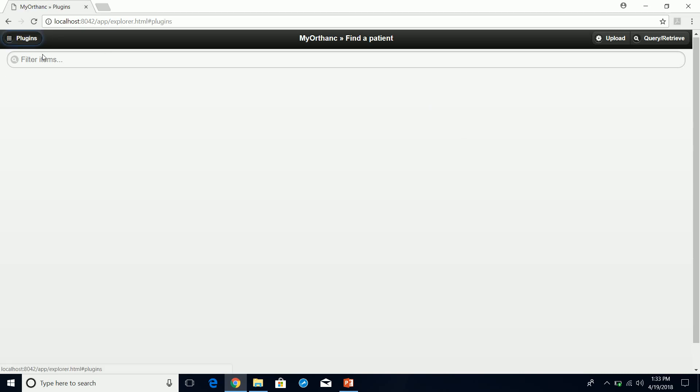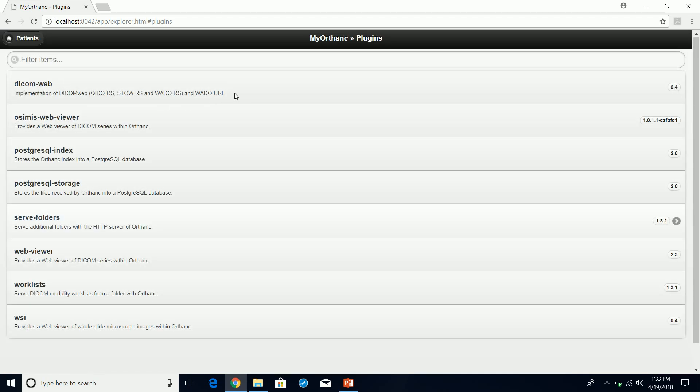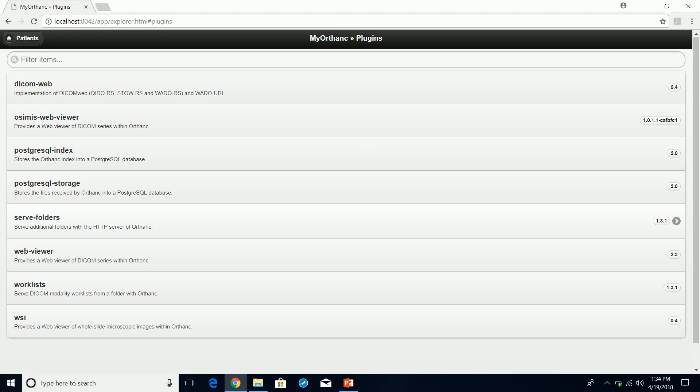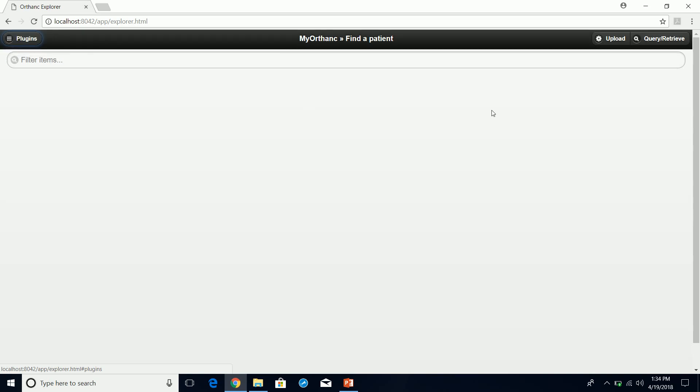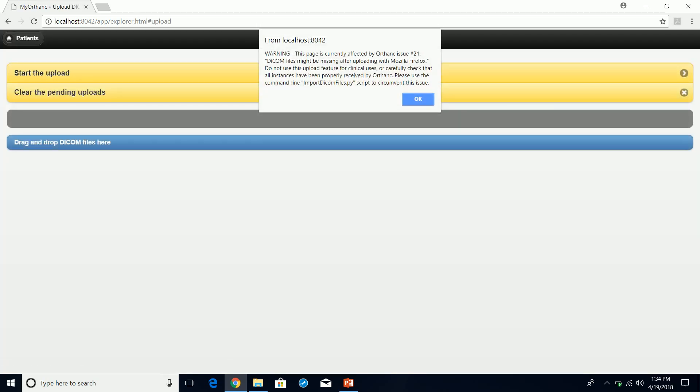It gives you by default some optional plugins - some of these plugins you have to purchase a license for. You'll see one down here that allows you to set up a modality worklist, which would be pretty cool. Maybe later on in the courses we can test out the modality worklist.